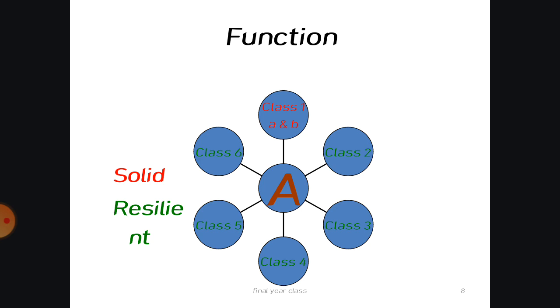Class 3 is again resilient with a hinge component of motion. Class 4 has both vertical and hinge motion. Class 5 is rotational and vertical motion with resiliency, that is, it allows some amount of rotational and vertical movement. And class 6 is universal rotation, that is, it allows movement in all planes.